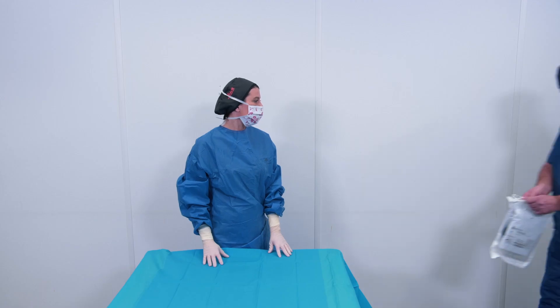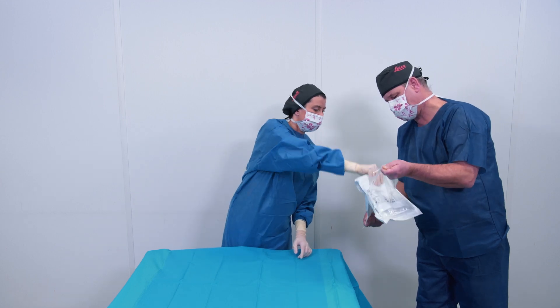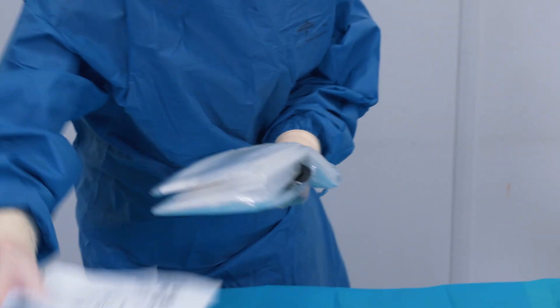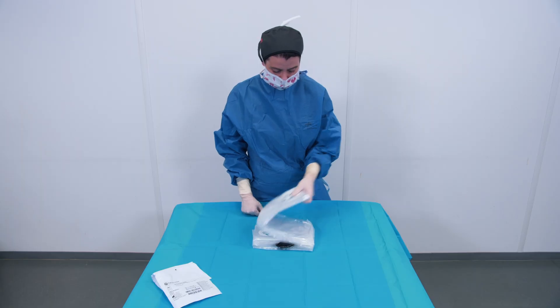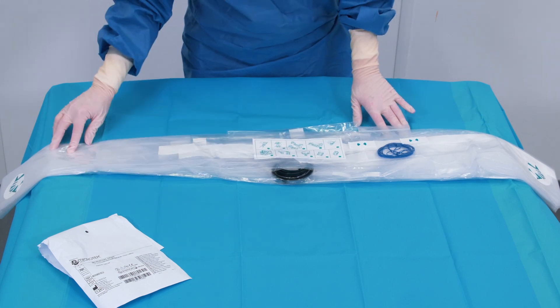The non-sterile nurse should open the drape for the scrub nurse. Grab the drape with the hand picture facing you. Unfold the drape, first to the left and then to the right. The instructions must be upright and facing you.